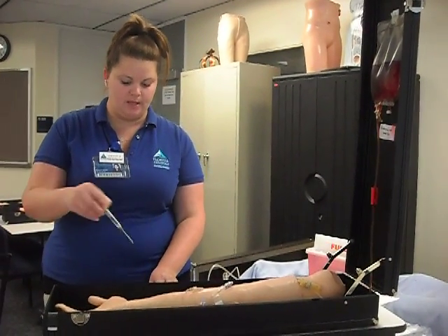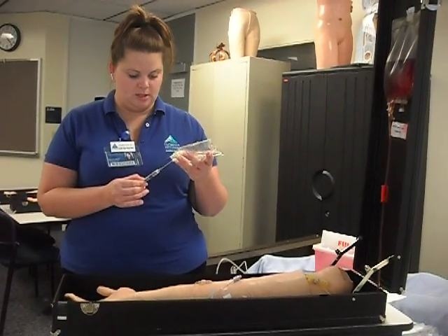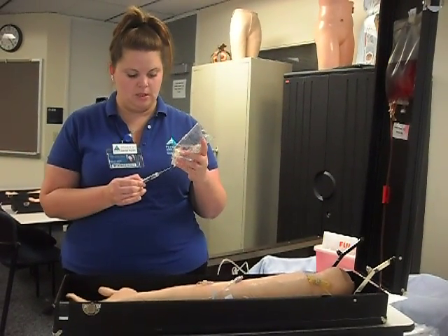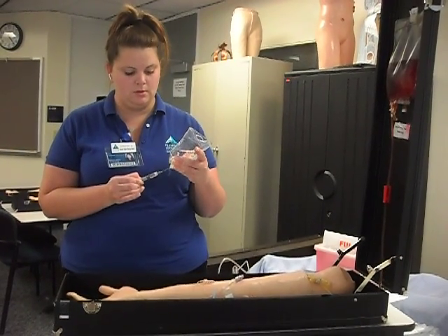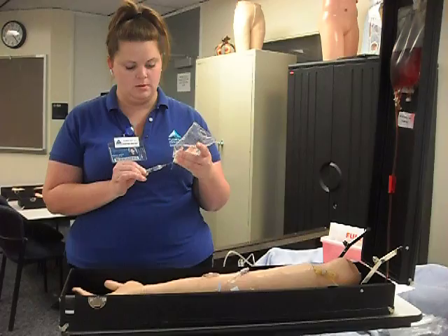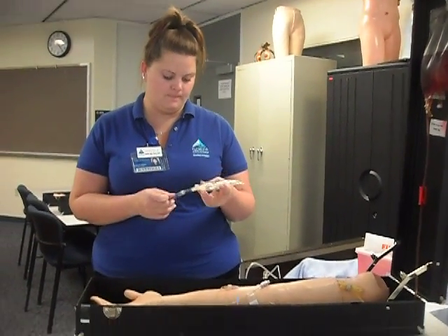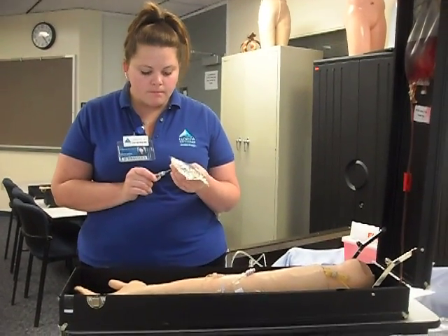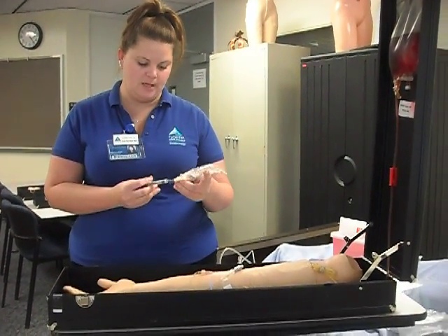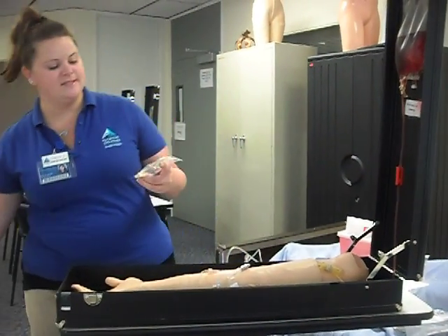And I'm going to take my bag and I am going to inject it, making sure that I don't puncture the bag. I'm going to inject the meds. I'm going to put my needle in the sharps container.